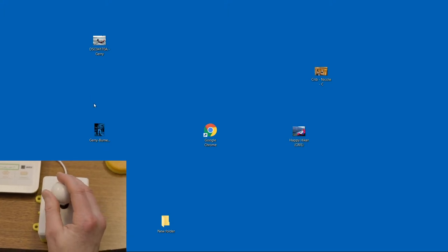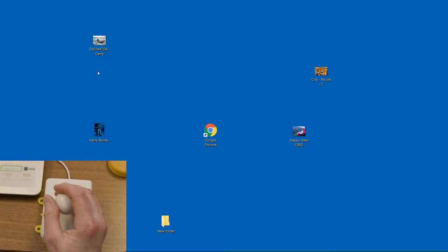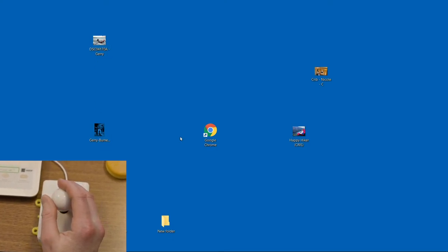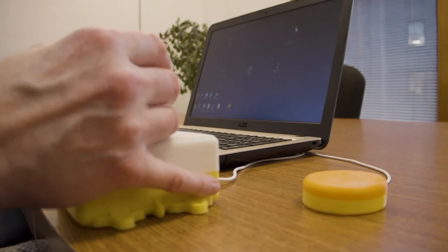When you move the joystick, the cursor moves. You can move it continuously in the direction you desire. You can pause briefly and tap the cursor to the desired location. When you let go, the NetClay hub will give a beep tone. This lets you know it is ready for another control function.